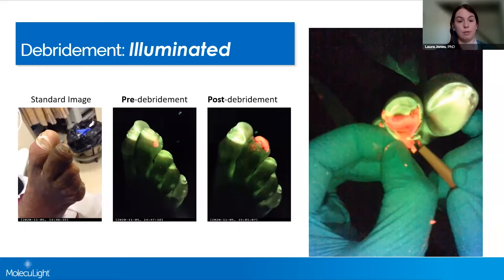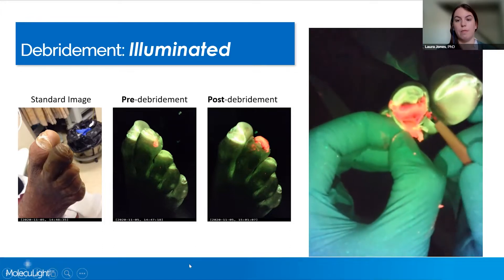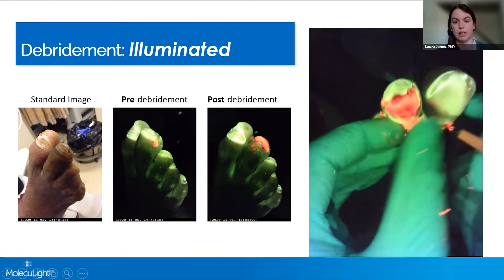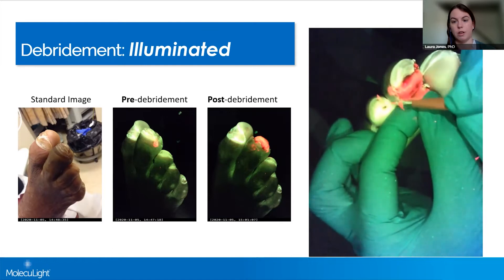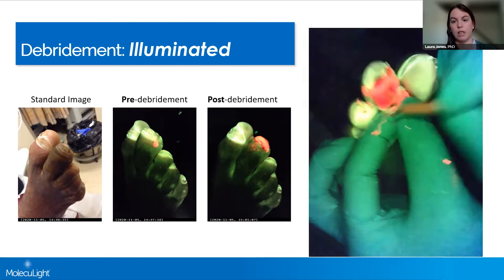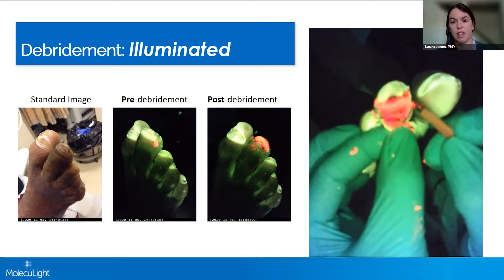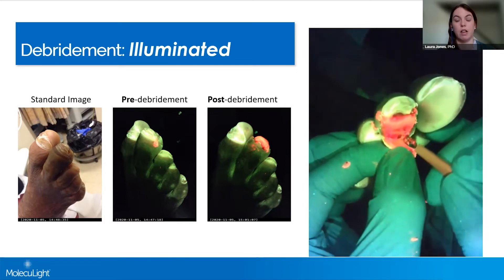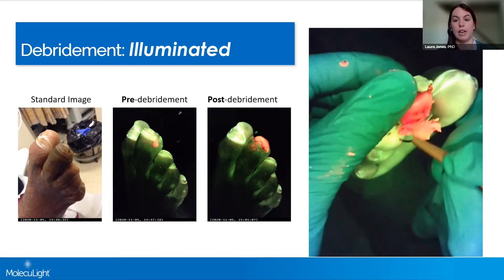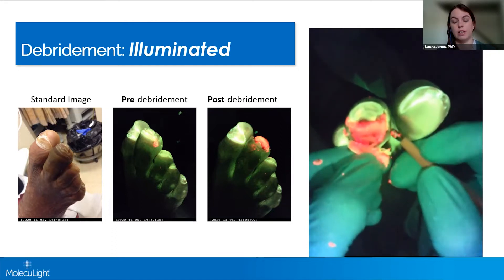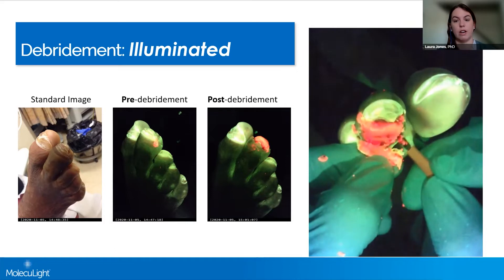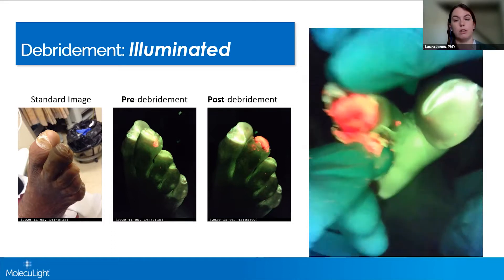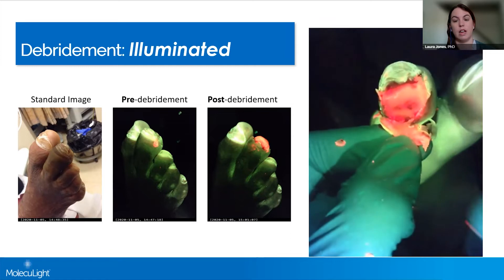As with cleaning, debridement also has implications. You can see there is a lot of red fluorescence in this toe. During debridement, she's really going in, removing that thick callus and discovering a lot of red fluorescence that's hiding underneath. And she can focus on that area of red fluorescence as she goes to remove as much of it as she can.